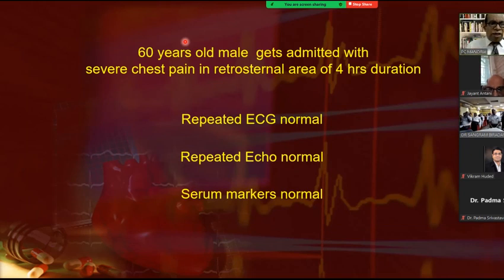Now, this is again a very interesting case. At times we see left-sided pneumothorax referred as acute myocardial infarction, but the easiest way not to miss a diagnosis of pneumothorax presenting as shock is to put a transducer on the left side of the chest. If you are unable to see the cardiac shadow, dextrocardia or pneumothorax should be sought, and if you put the transducer in the epigastrium, you will see that the heart is grossly shifted.